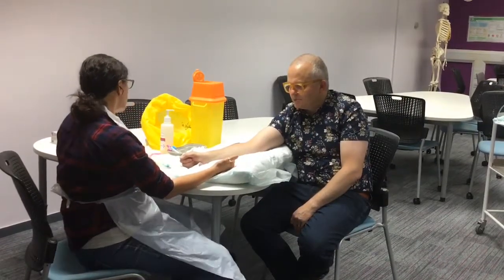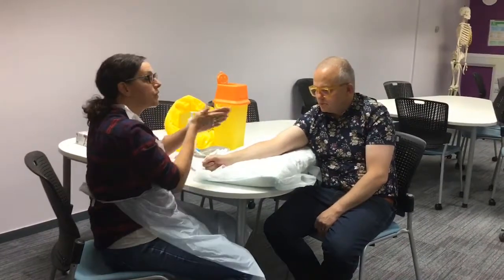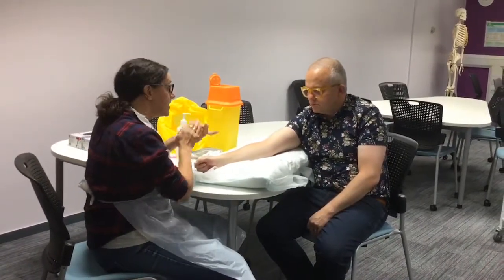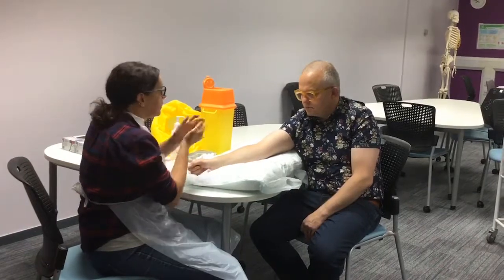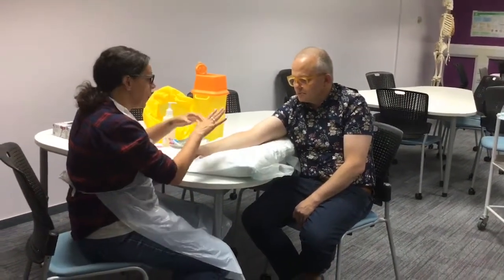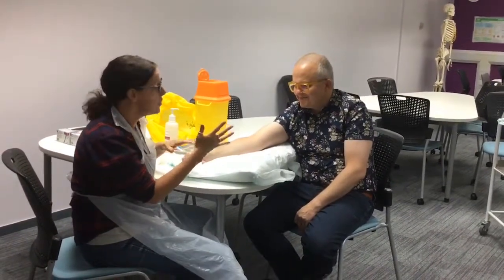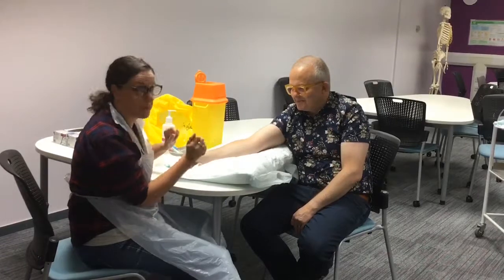What I'm going to do first is put some hand gel on. I've washed my hands in the sink and I'm just going to put some gel on just to locate and palpate the vein. Obviously when I take the blood I'm going to wear gloves, because that's just what we have to do as safe practice. I should also have removed my rings.